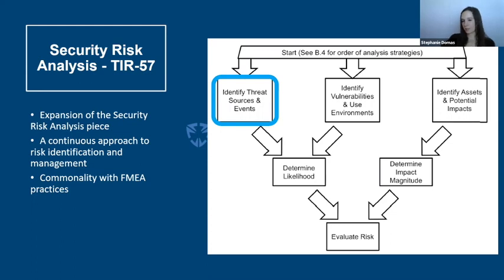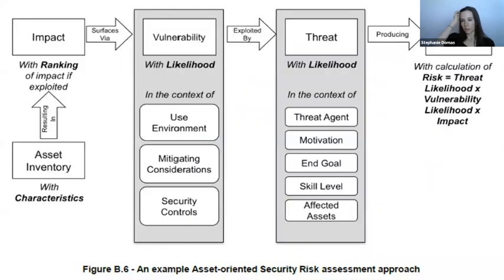So once we have this box, right, we know when we threat model, then the activity of actually doing it comes up. So we're going to talk briefly about some techniques for approaching threat modeling. Inside of AAMI TIR 57, you'll find there's a couple of different high-level approaches. I will be the first to say that there is quite literally an endless number of methodologies out there for doing threat modeling. There is no shortage of them.